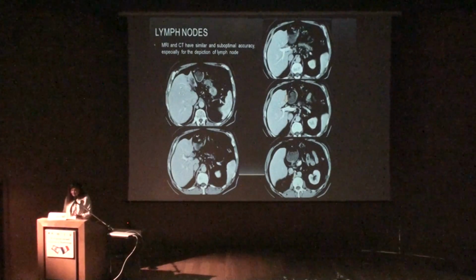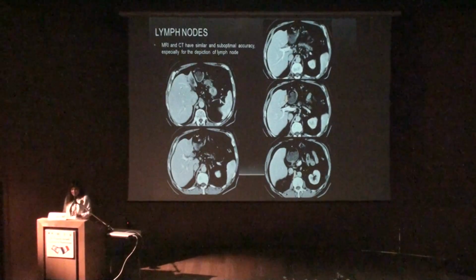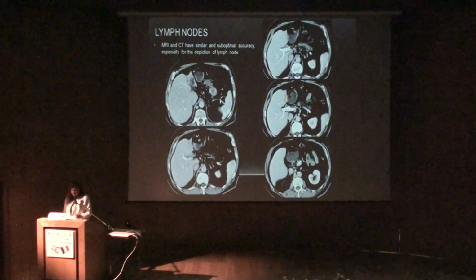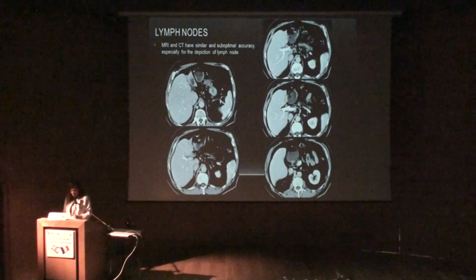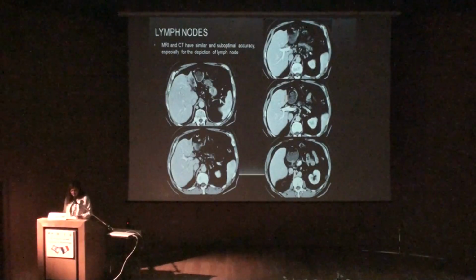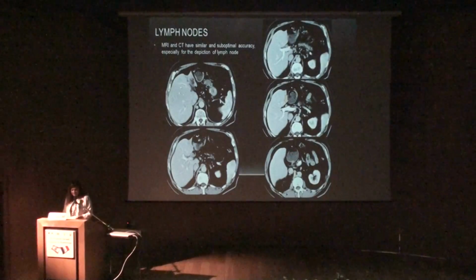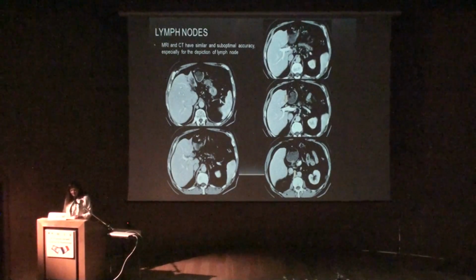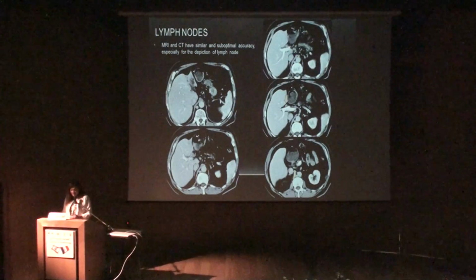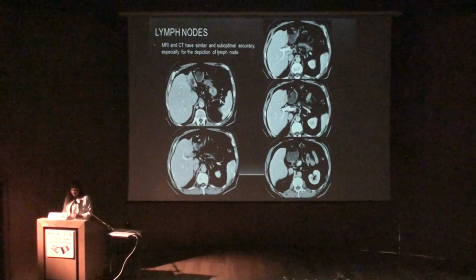But because they were small in size, we had no doubt. We think that this patient can go to surgery. But it was not resectable because this lymph node, after picking on operative surgery, was a metastasis. So it's very difficult to tell, okay, don't operate on this patient because this lymph node is metastatic. So we have a big problem with that, and the PET-CT doesn't really resolve this problem. So you have to mention it, but I don't think you can really tell, at least if it is a very big one, it's a metastatic lymph node for sure.